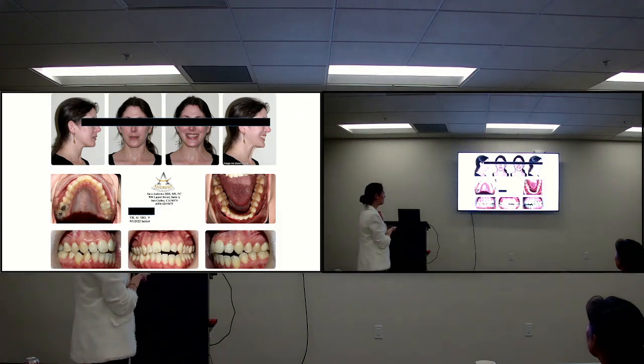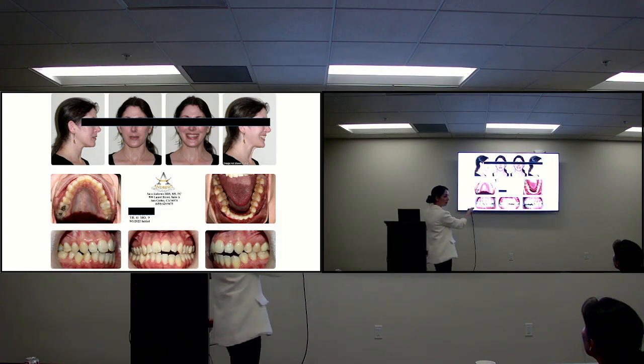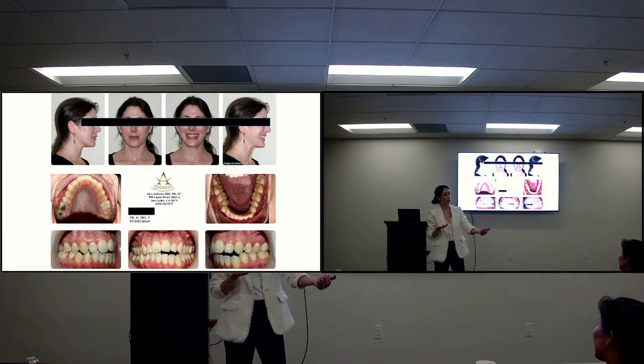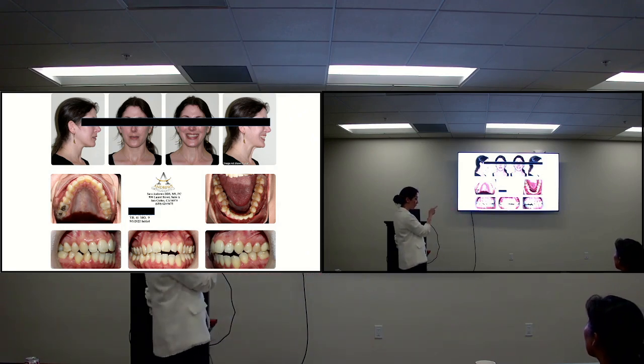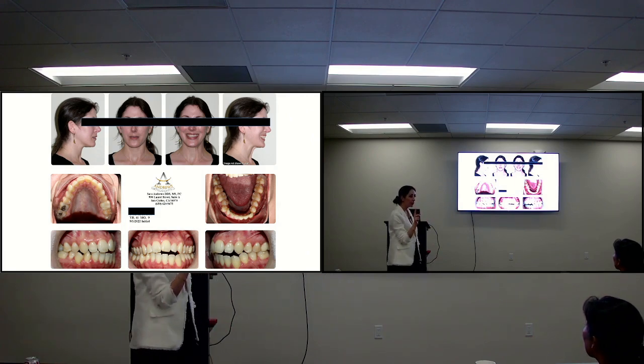So this is a super sweet lady, very, very busy with her work. Look at that lower lingual bar. Just stuff like this makes you scared of these lingual retainers, right? I can't tell you how many cases I've seen where one root's completely out of bone, with massive recession, and the other root's completely lingual. These wires can become active. I don't know if this one's gotten active actually. Something funky's happened with this fixed lingual retainer, but really carefully look at those.